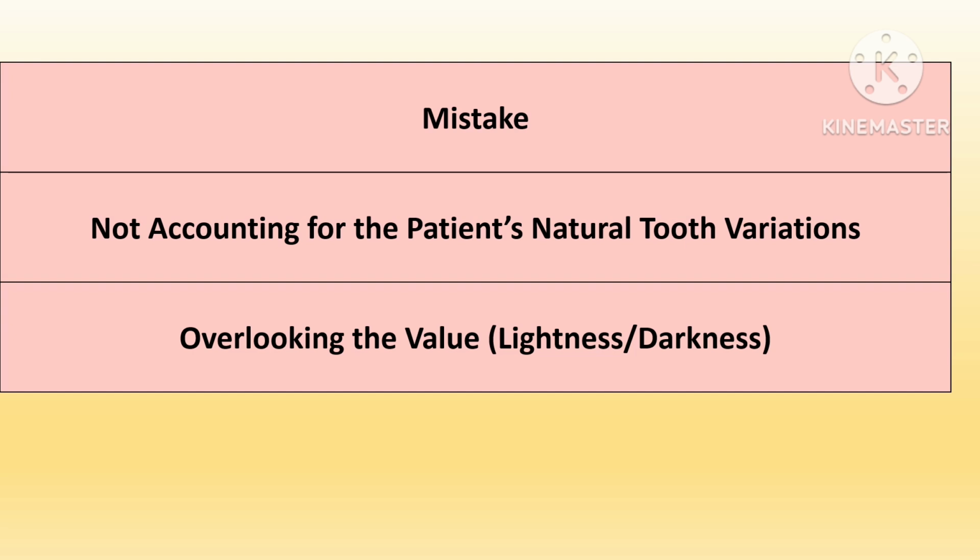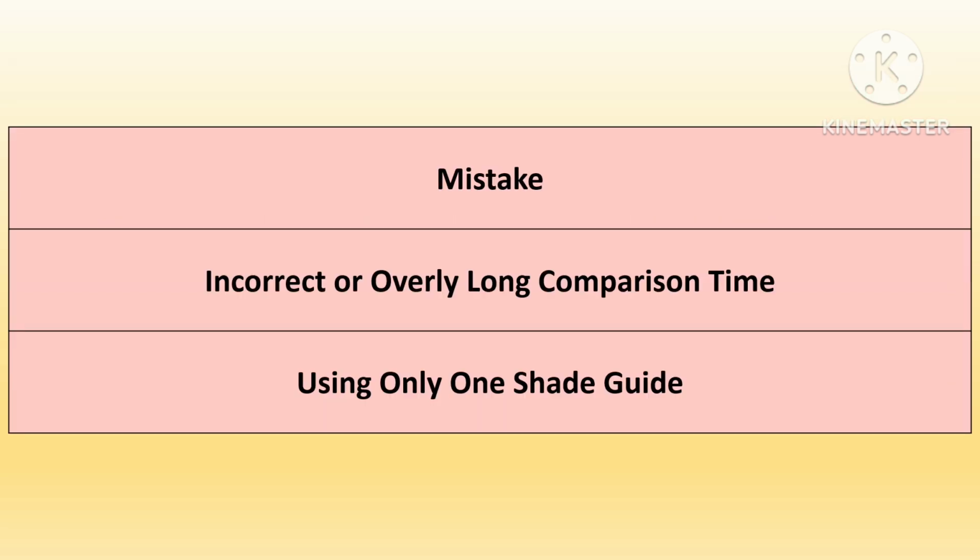Taking too long to make a comparison leads to visual fatigue, which can distort perception of the color. So limit your shade selection to about 5 to 7 seconds. If uncertain, look away or blink to reset your vision before proceeding with the final judgment.